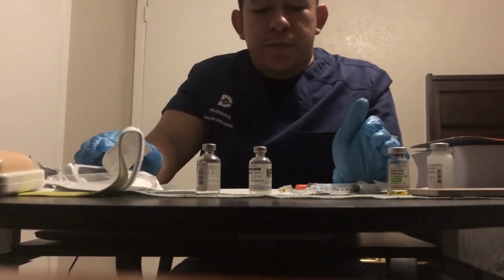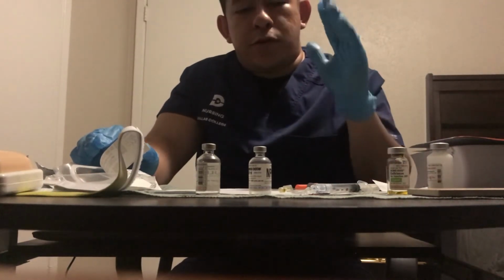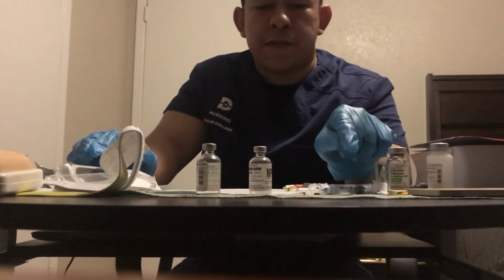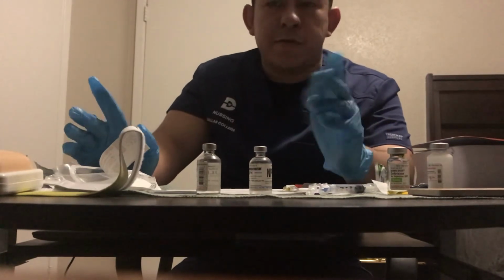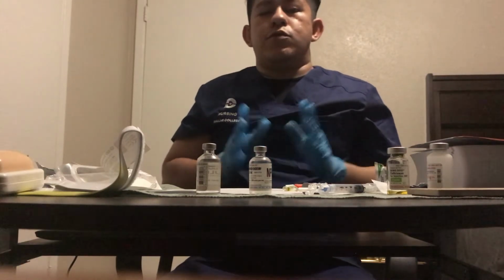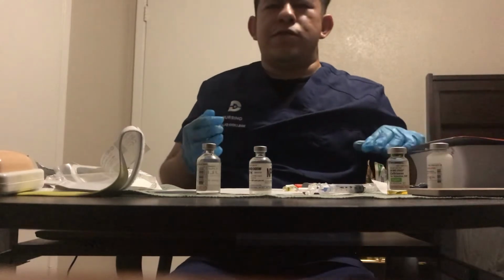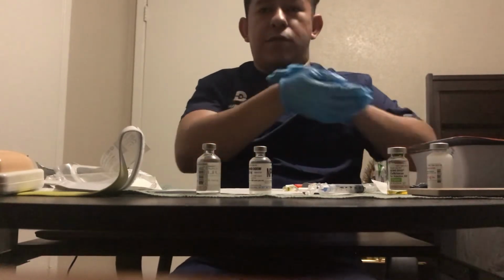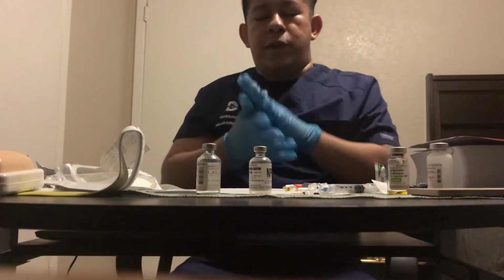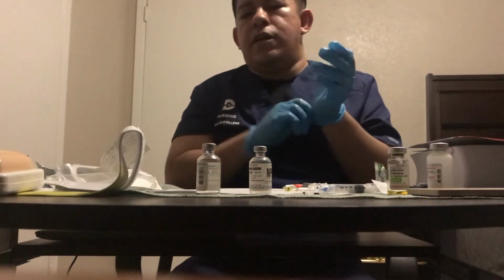We prepared our meds. So now we're going to walk over to the room where we will do our third check, put a new needle on this syringe that's containing the ceftriaxone, and administer the injections. So I would walk over to the patient's room, and of course, before I leave the medication room, I would take off my gloves, wash my hands, and I would knock on the patient's room, do my hand hygiene again for another 30 seconds, put on some gloves, and introduce myself.